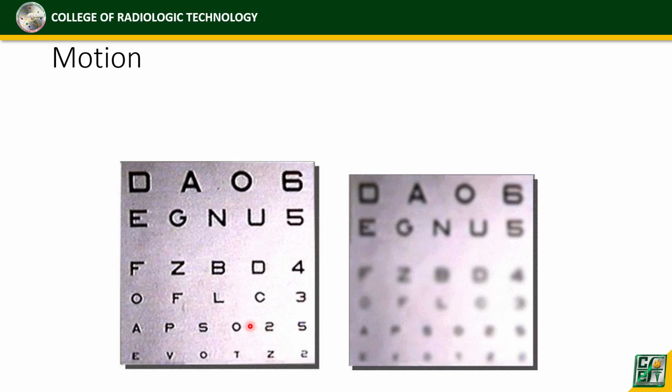Okay? Yung recorded detail, okay, lalabo. Okay, pag tiningnan natin yung film under the or sa negatoscope or sa view box, minsan yung ribs, halimbawa kung chest yan, yung ribs, okay, talagang makikita mo na gumalaw kasi may overlapping ng ribs, etc. Okay? So motion, number one yan.